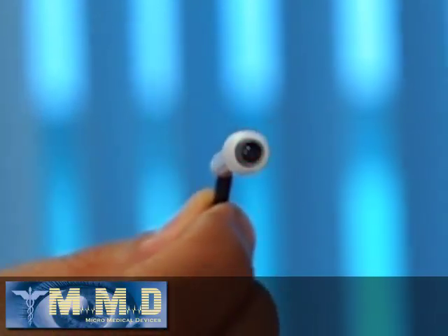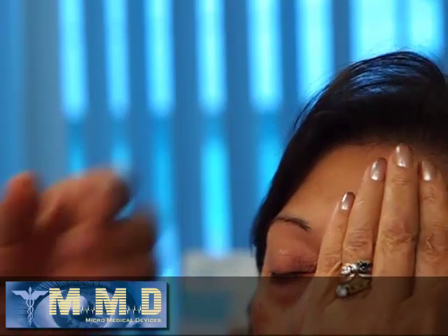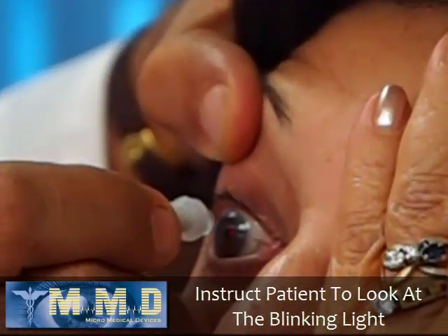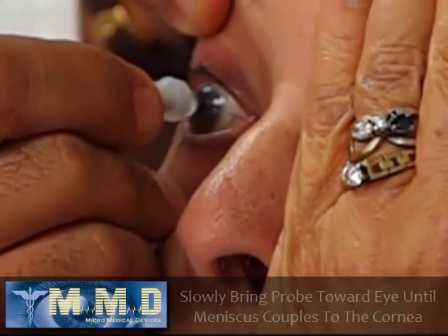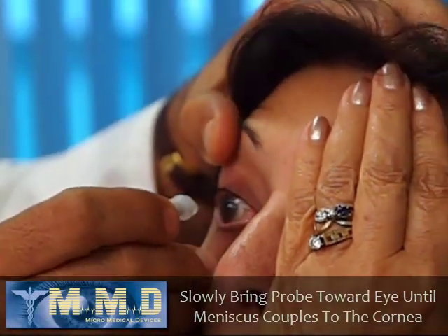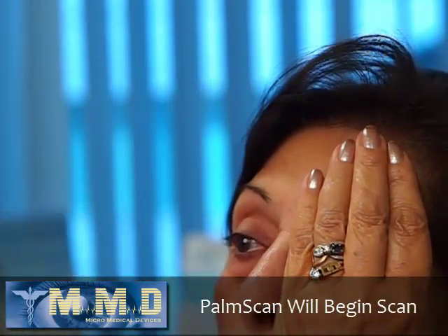As you can see, there is a blinking red light. I instruct the patient to cover the fellow eye and look at the blinking light. Then I gently come forward until there is a connection between the meniscus and the eye — and as you heard, the machine will do the scanning.